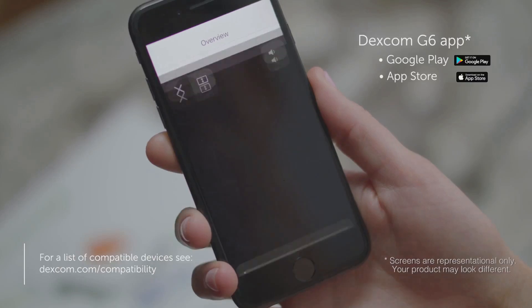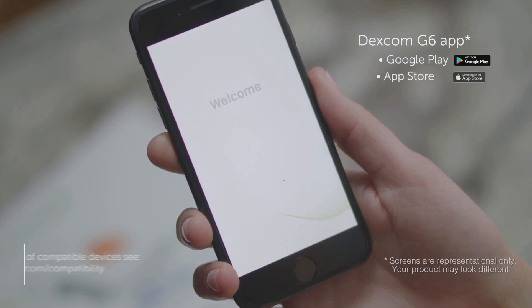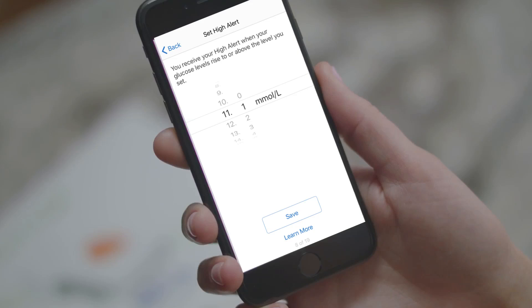The app walks you through the entire setup process step by step. The first few screens provide information and videos. Watch these videos and read the information screens. You will come to a screen where you need to set your low alert. Tap save to set your low alert. Now, set your high alert. You should work with your healthcare professional to determine which low and high alerts would be best for you.